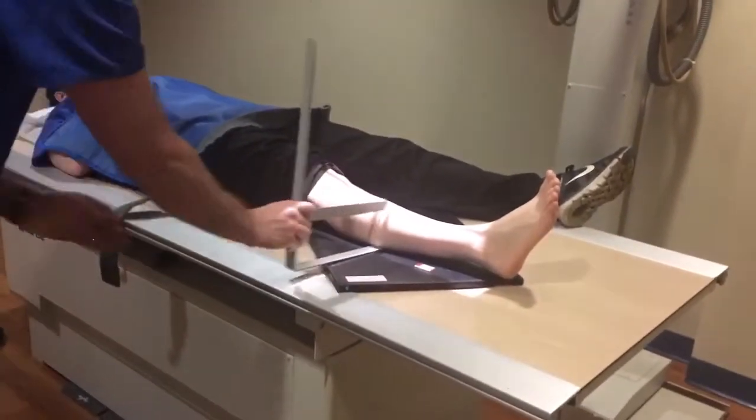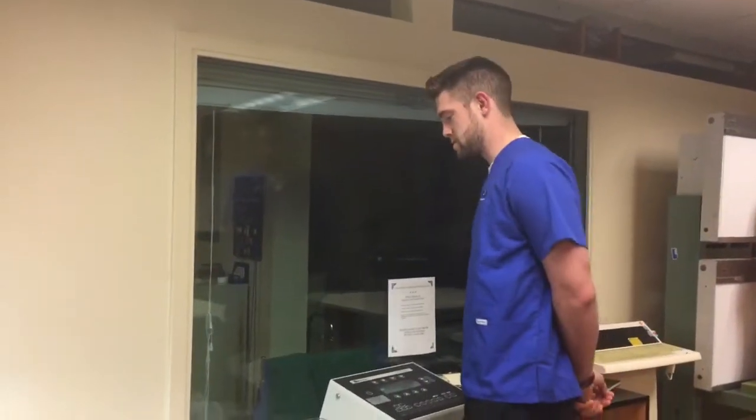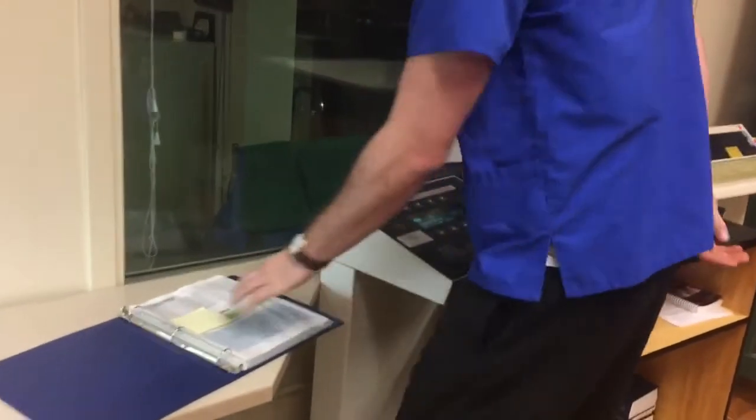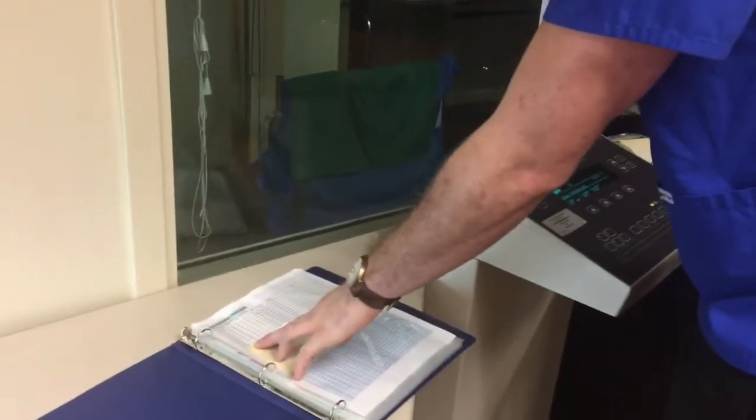She measures a 9. So I'll now shut the door and set the control panel. Out here at the control panel, we'll be using the extremities non-grid table, and we go to 9.